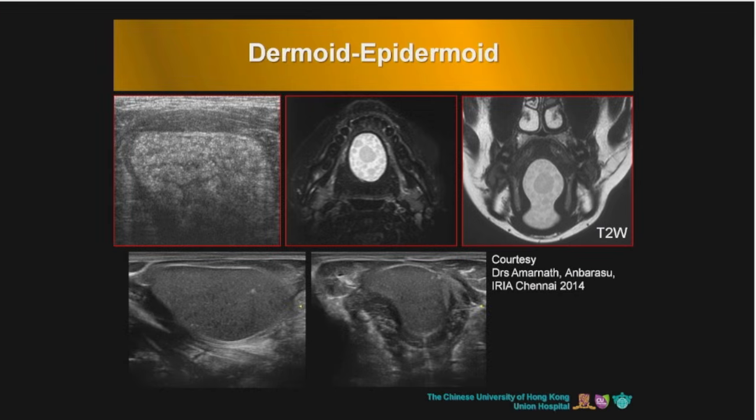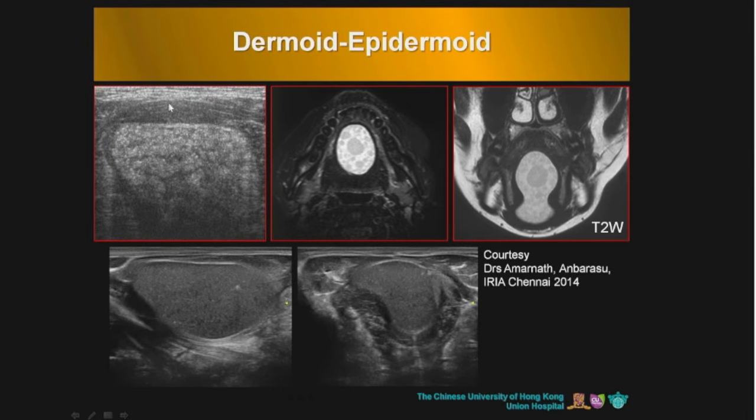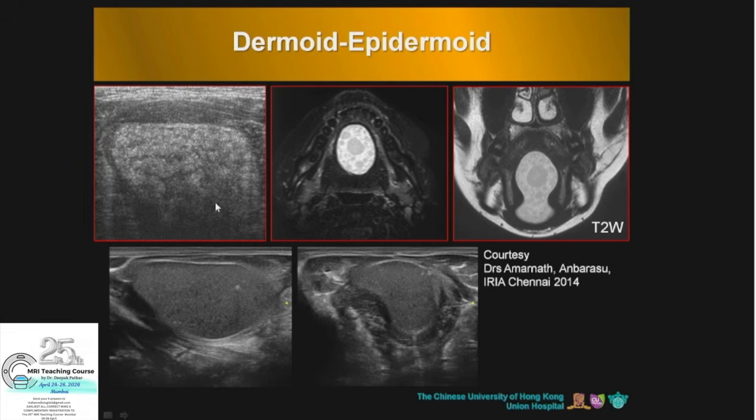Now when we did the anatomy, remember this is transverse submental. So that's the anterior belly of the digastric, that's the anterior belly of the digastric. This anterior belly on the right, this is anterior belly on the left, that's the mylohyoid, that's the mylohyoid. I should have seen the geniohyoid over here, I should have seen the genioglossus over there.